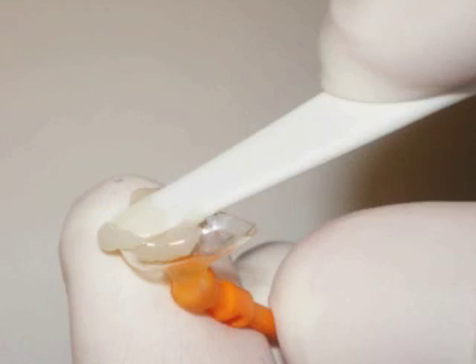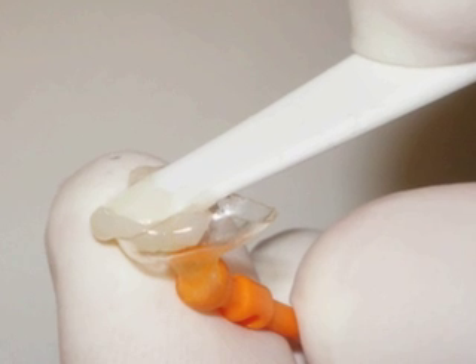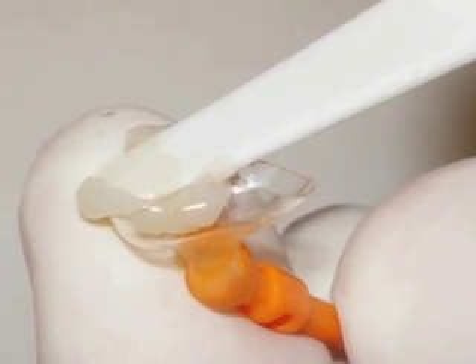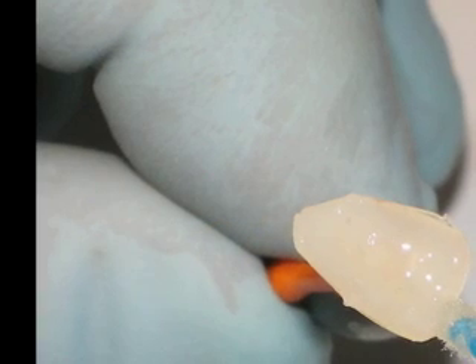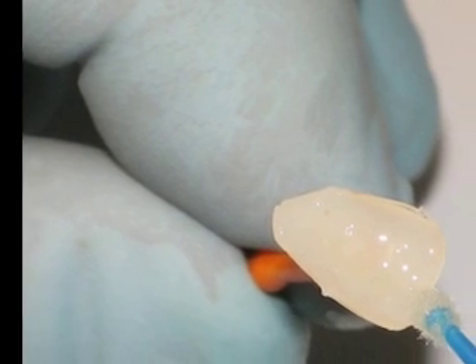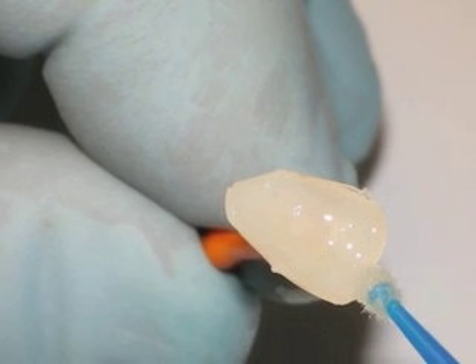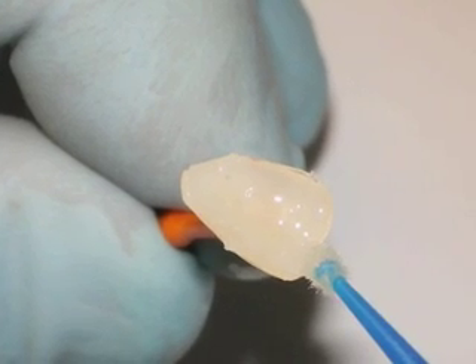While keeping the target tooth dry and isolated, my assistant will load the face-o-form with an even layer of my chosen composite. Usually, one to two millimeters is adequate. The composite itself is very thick and may need some thinning with sealant to make it more workable. She will tamp down the composite with a sealant-covered pledget to make sure that there are no voids on the labial surface.